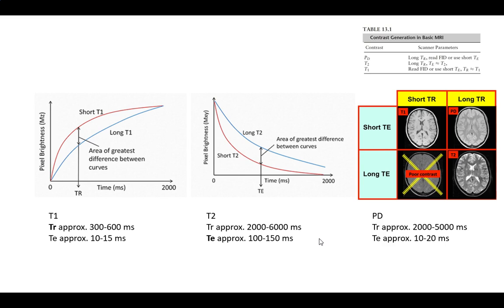Now, there are all kinds of other fancier ones that go on. The question of why we care about them, the fun thing between these two, T1 and T2, has to do with how fluid responds to them. So if you're wondering why they do it, T2 tends to give a better signal strength to fluids than T1 does. In general, since most problems in the tissue are associated with fluid buildup, because if your system's out of line, whether it's cancer or whatever else, you tend to cause fluid buildup in those tissues.